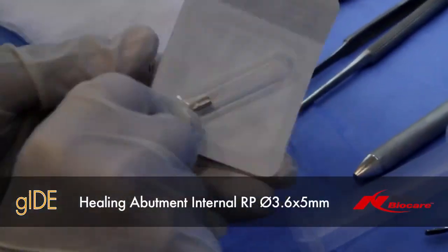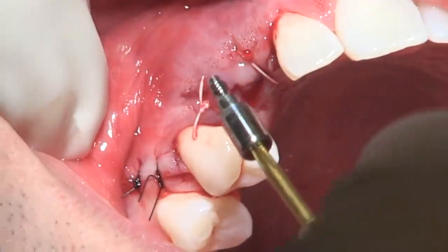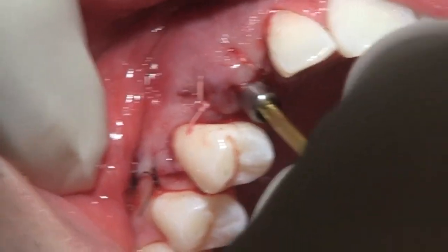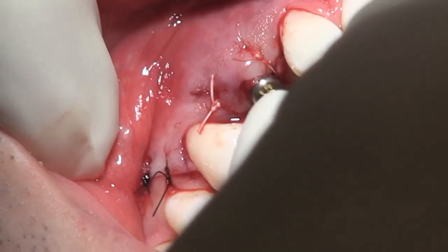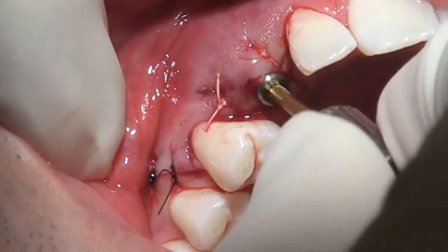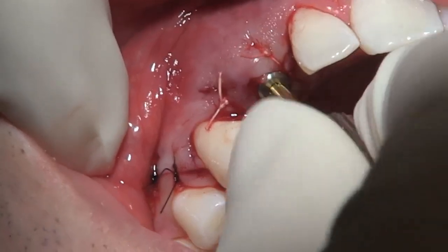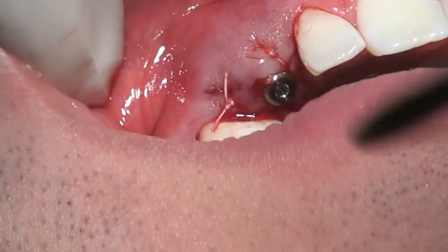A healing abutment of appropriate height is chosen, here 5 millimeters, and will be secured into the implant site for the period of the fabrication and modification of the abutment as well as the temporary acrylic crown. Stabilization of the healing abutment will be maximized at 20 Newton centimeters.